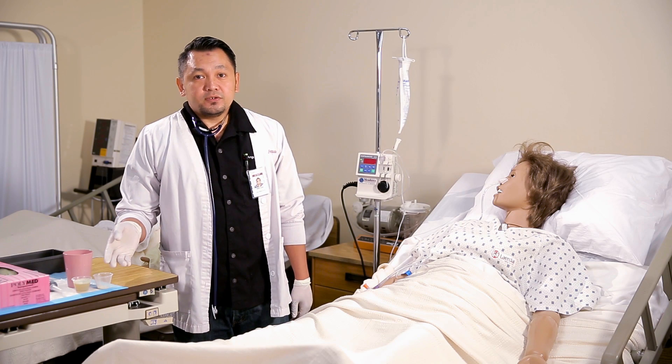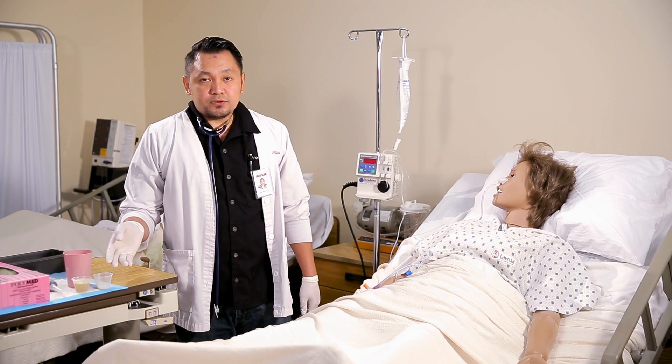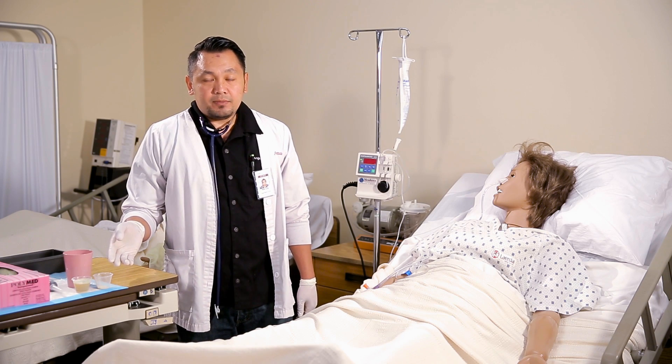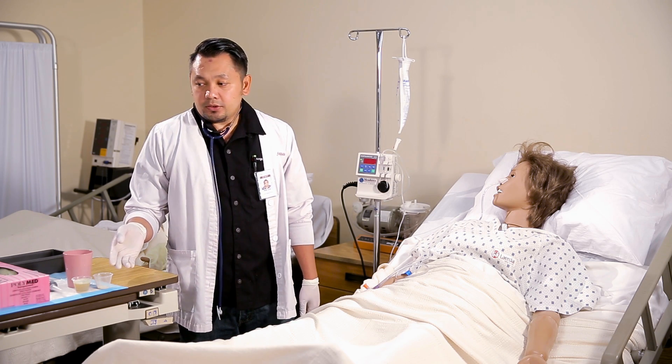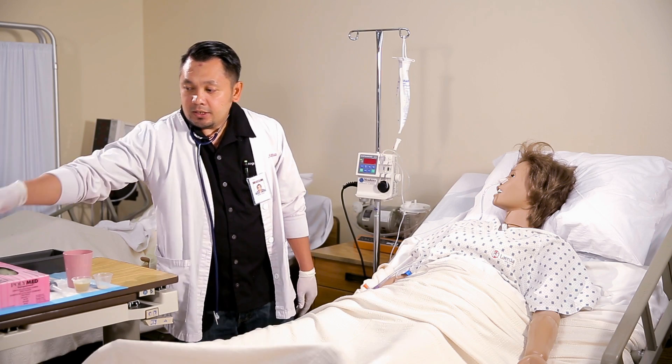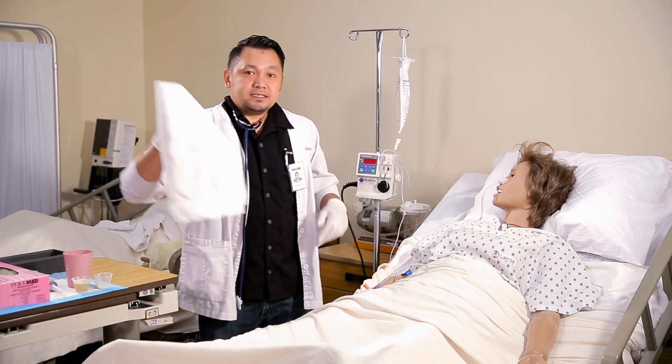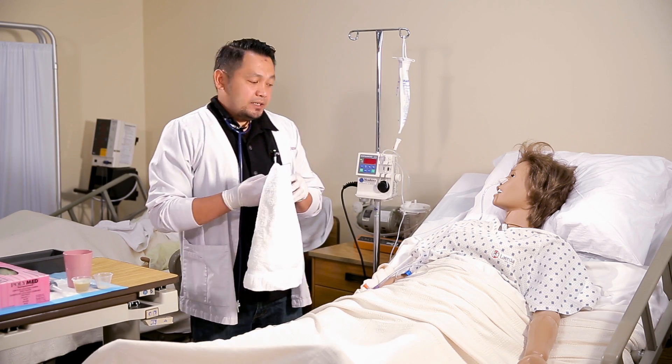Then we need to remove the medication. Crush any pills or open any capsule and dissolve in 15 mLs of water. Make sure that we place a towel over our patient.